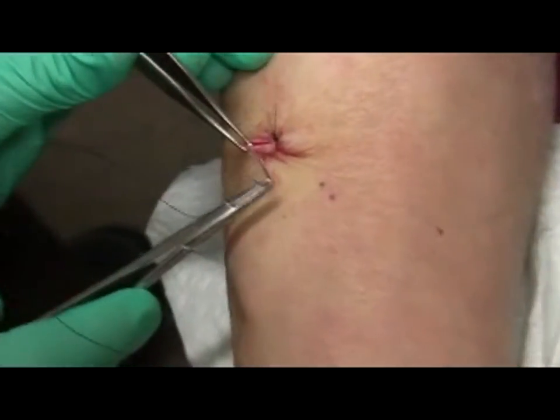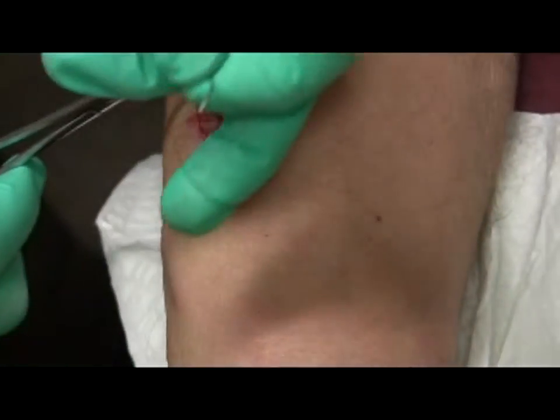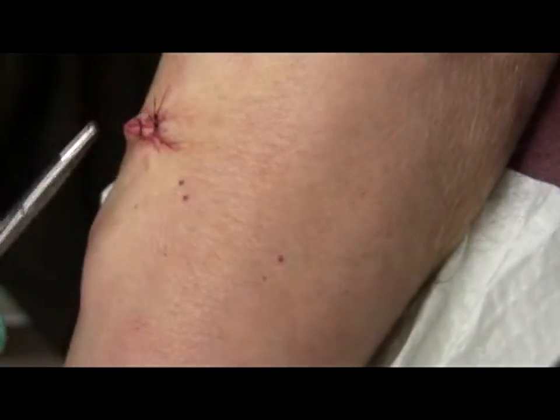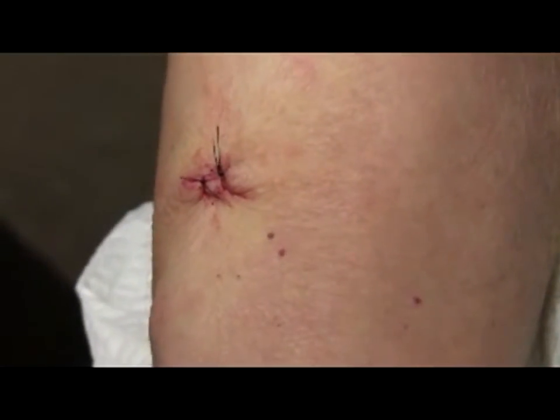Cut the suture as above. To determine if you need an extra stitch, wait about ten seconds — if you have not achieved hemostasis, likely you could use another stitch or perhaps place a pressure dressing. Be sure all wound edges are firmly touching each other. Pick out suture ends from underneath the knots so you can grab them in two weeks at suture removal, otherwise they get buried in the serosanguinous crust. Clean the wound with hydrogen peroxide soaked gauze, then apply wound dressing — bacitracin ointment and a band-aid. Here we've achieved hemostasis and wound closure. These dog ears will settle out once the stitches are removed in two weeks.